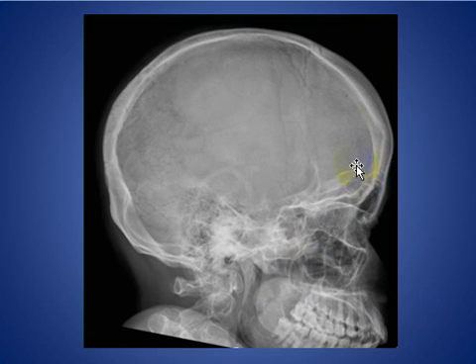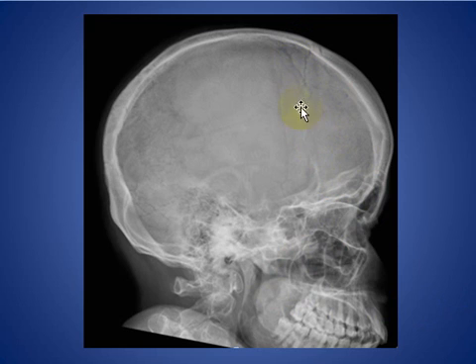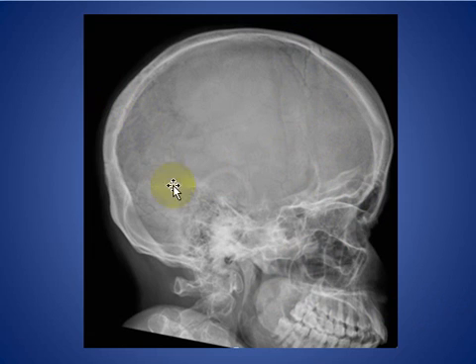...a lateral skull X-ray of an adult patient. You see here the coronal suture, and you see here the lambdoid sutures not overlying each other.